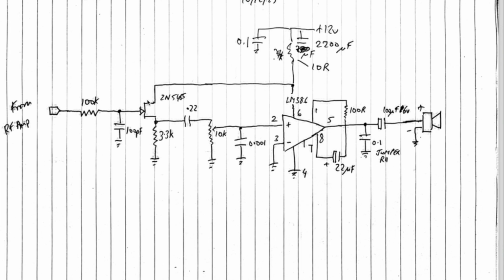So you've got some more amplification there with that FET, and then you've got an old favourite here. For those people who do amateur radio and are familiar with QRP rigs, you'll notice the LM386, the ubiquitous 3-watt audio amplifier chip. Now this you have to be quite careful with, because it does tend to self-oscillate if you're not careful. The gain is adjusted with this capacitor and this resistor, which you can play around with. But make sure you put quite a sizable capacitor. I think they've got it shown here.